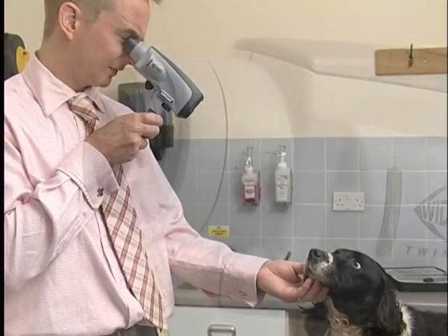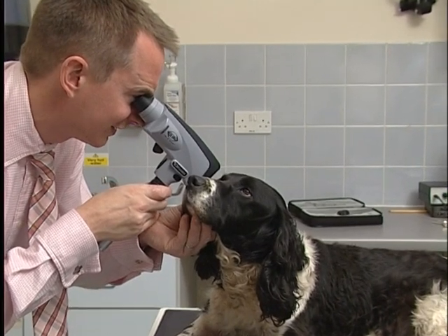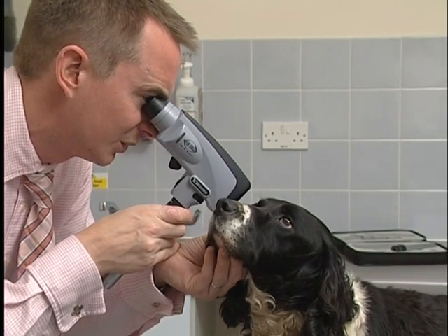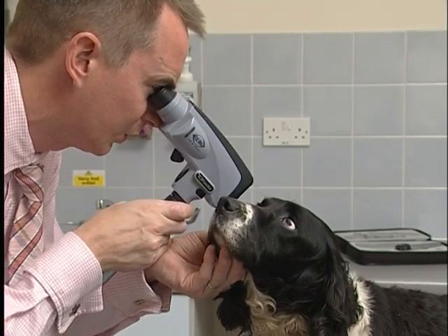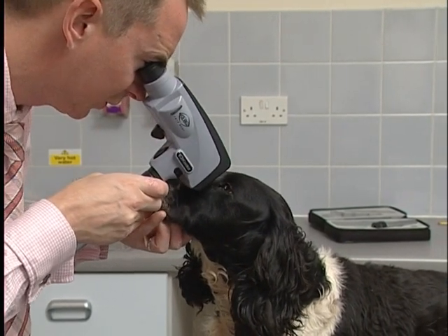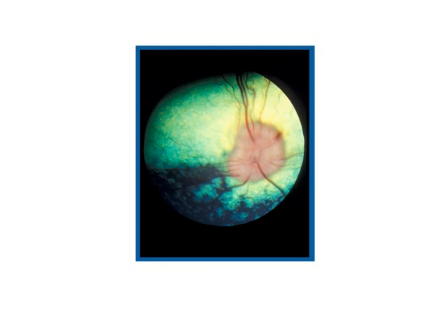This instrument combines the advantages of a direct ophthalmoscope with those of the indirect ophthalmoscope, leaving the image seen as real, direct and large. For comparison with the other two ophthalmoscopy techniques, the wide angle will give a visual field of approximately 25 degrees, as opposed to 9 degrees with the direct ophthalmoscope, 56 degrees with the 20 diopter hand lens. Therefore, the visual field is about half that of the 20 diopter hand lens, but about 3 times that of the direct ophthalmoscope. The image is also the correct way up instead of inverted, and not back to front as with the indirect ophthalmoscope.